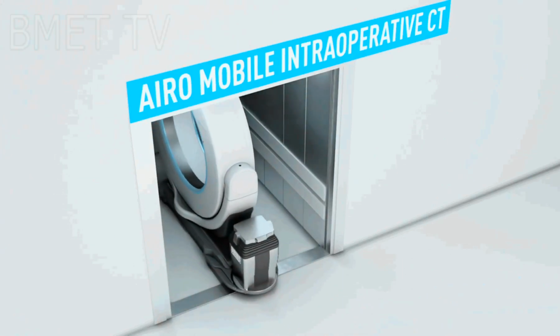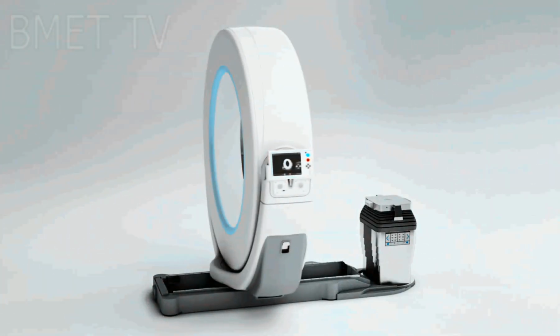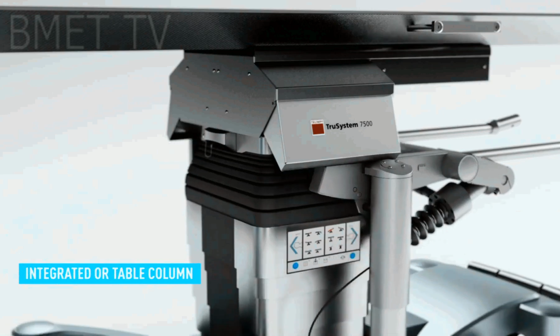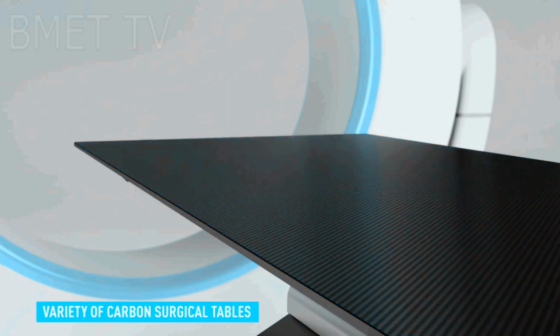The third type of CT scanner is the mobile CT machine. It's important to note that CT machines are capable of going mobile. This is useful for many situations, especially if you'd rather not make a commitment. For example, if your current CT suite is under repair or renovations, you may want to rent a mobile CT machine. Perhaps you have lower patient volume at several locations. In this case, you could transport a mobile CT scanner for specific intervals of time to each location when needed, rather than investing in several types of CT machines.